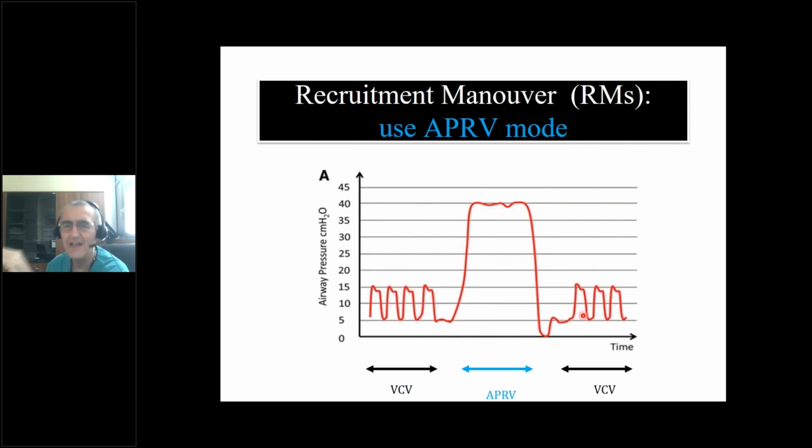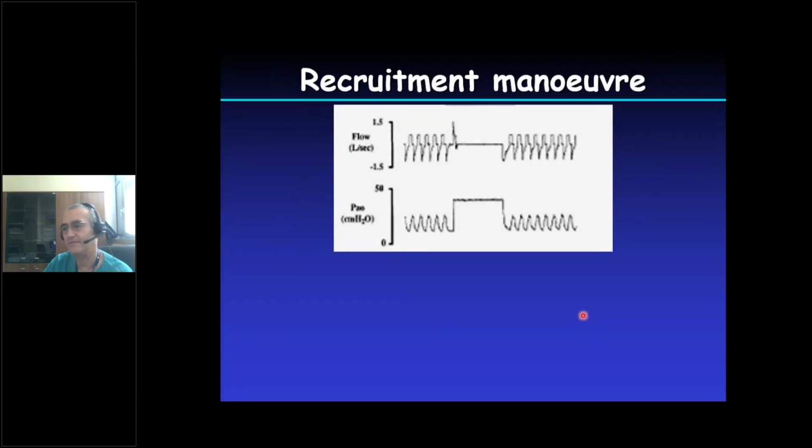Very easy, safe, and obviously you have to be very careful, but with little hemodynamic impairment. I'm not going to discuss other maneuvers that I think are more dangerous.